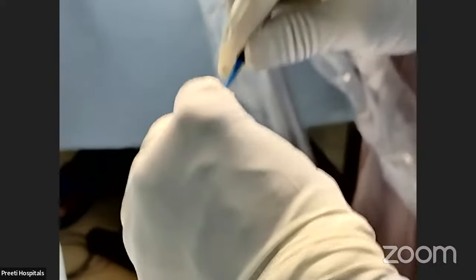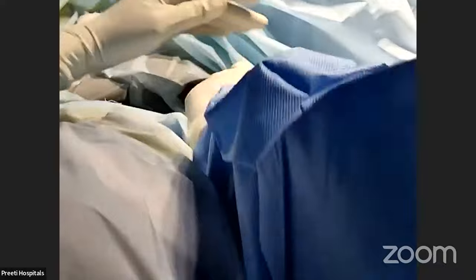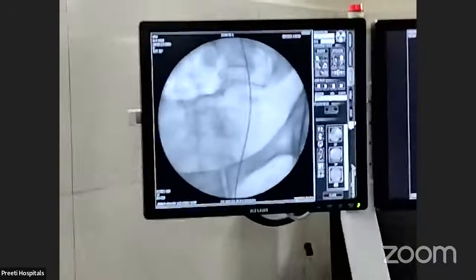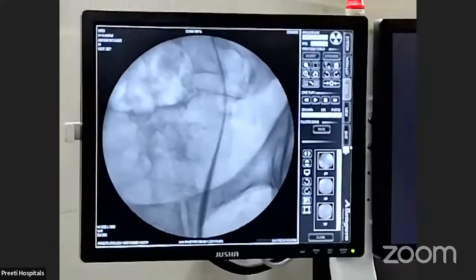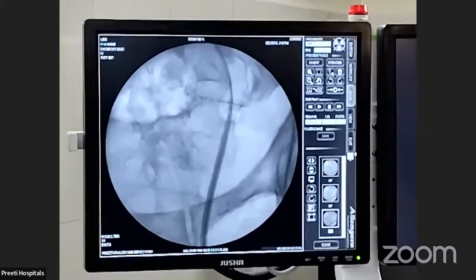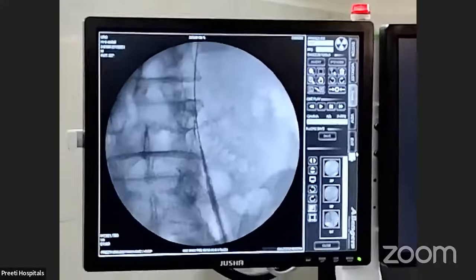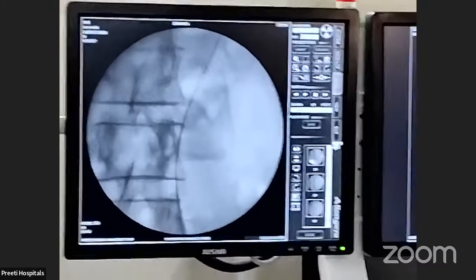Now this is a sheath which I am passing, wetting it with this. This is a long sheath. One should be careful. Come down. The very thick guide wire, 0.038. Now I am going inside. Basic principle is the same, stretch the penis. Patient is under general anesthesia. C-arm there. Now it will come there. Yes, see, it is coming there. You are passing gently. It is going freely. Go up. You are passing gently, it's going up.